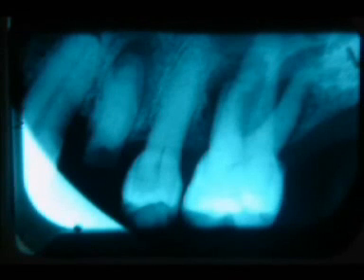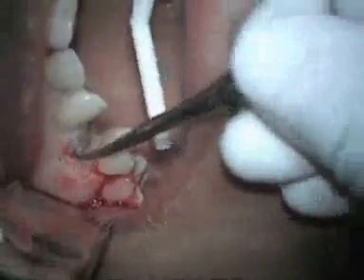This patient is a 54-year-old African-American female who presents for extraction of teeth numbers 3 and 5. First, I am separating the gingival attachment from the tooth using a periosteal elevator.